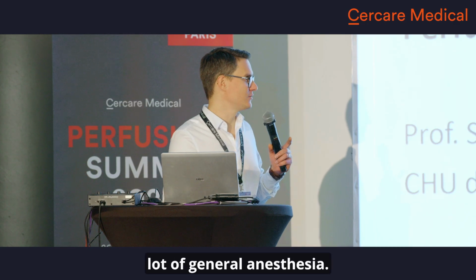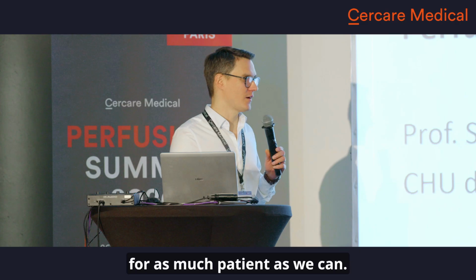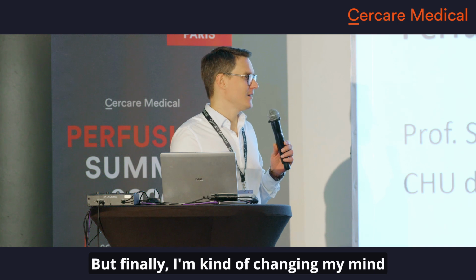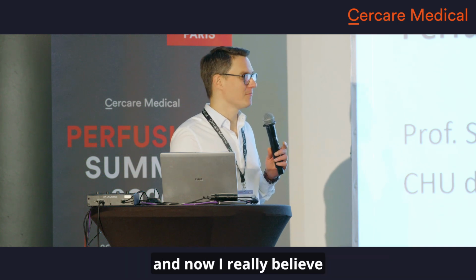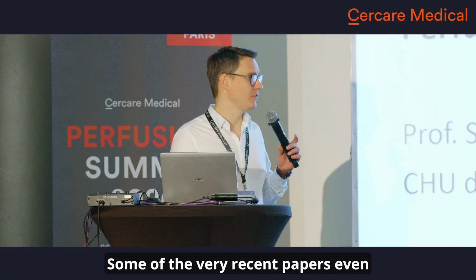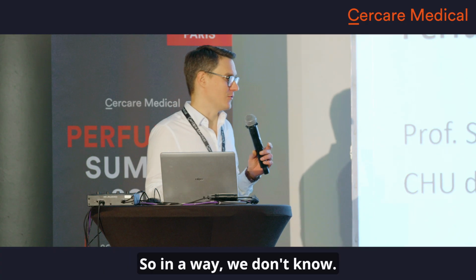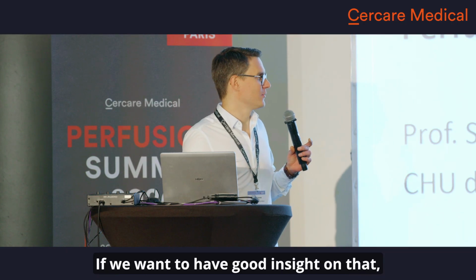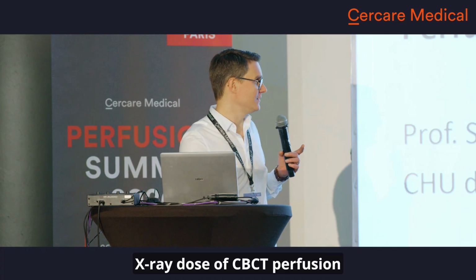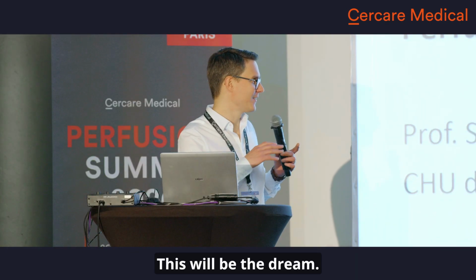In Reims, we don't do a lot of general anesthesia. We are still much more performing under conscious sedation for as many patients as we can. But finally, I'm changing my mind, and now I really believe there's almost no difference with general anesthesia. Some of the very recent papers even favor general anesthesia because you get faster. So in a way, we don't know. If we want to have good insight on that, we need to decrease the X-ray dose of CBCT perfusion, so we can do 2 or 3 CBCT perfusions within a procedure. This will be the dream.